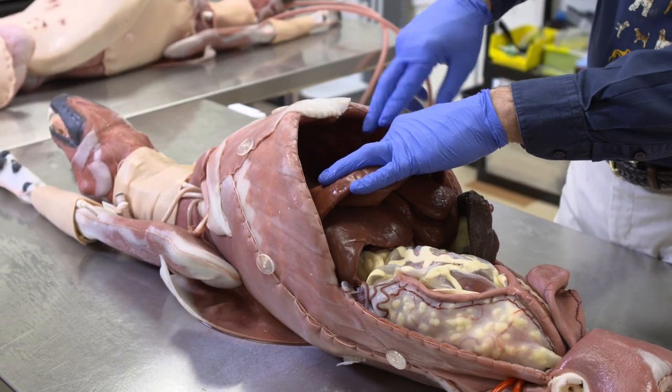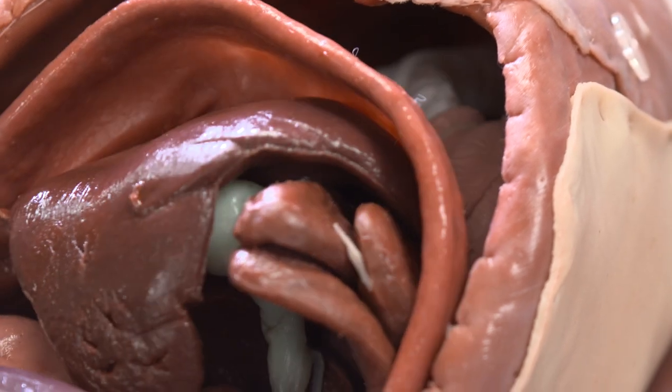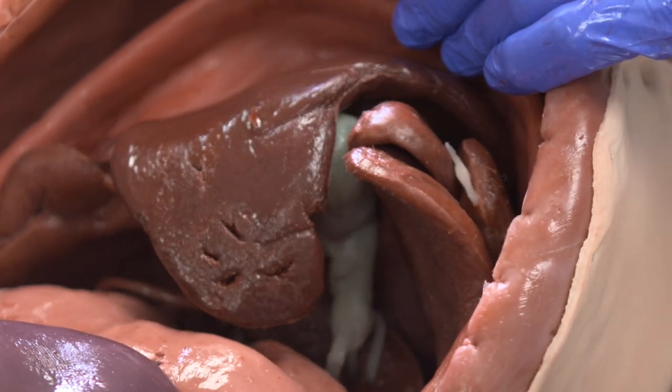Looking into the chest cavity, there is a heart, as well as you can see both lungs and the bifurcation of the trachea. Since this can be intubated and hooked to a respirator, the lungs will expand and you can, of course, adjust that to enhance the scenario.